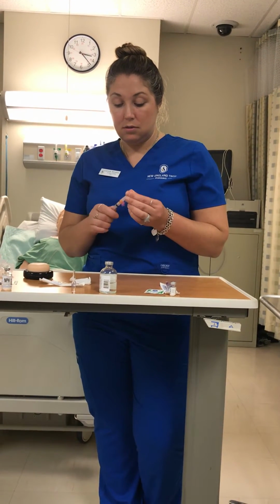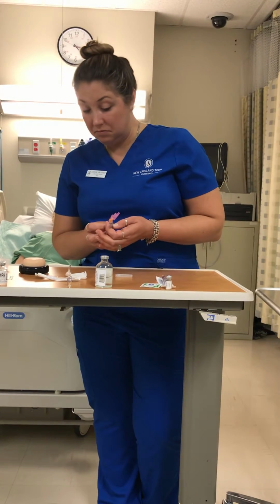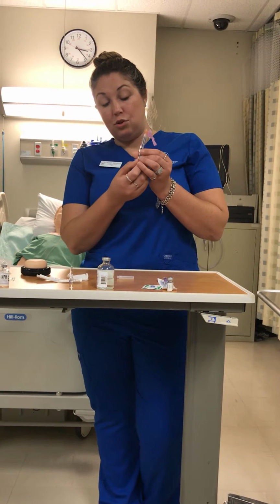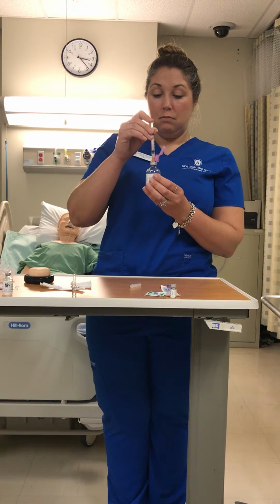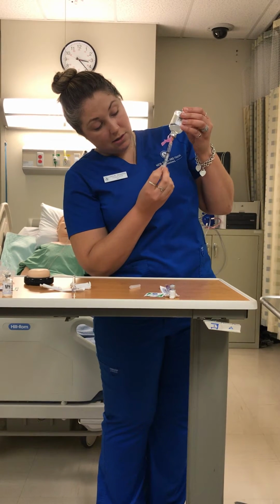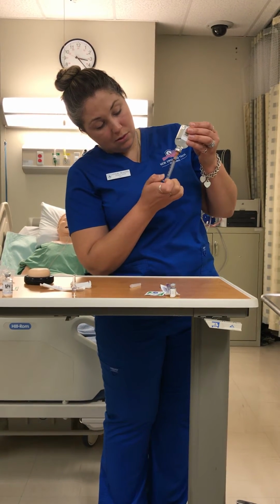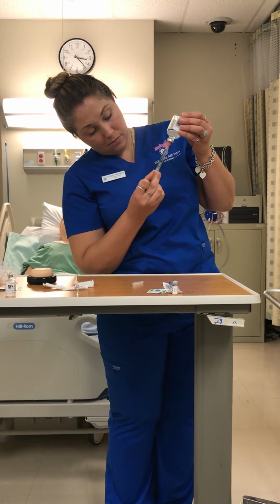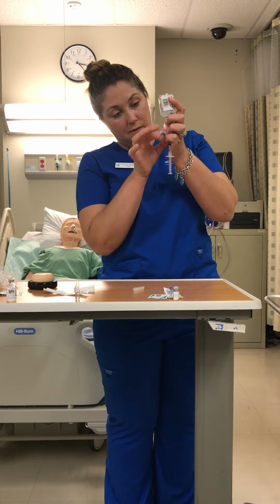Okay, you have to administer this one, take the cap off. You can say they needed 2 milliliters of medication. You would pull the plunger back to the 2 milliliter mark, stick the needle into the vial, plunge the air in, flip it over, and see how there's some air bubbles in there? You can push to get the air bubbles out. And you pull back to the 2 milliliter mark. Flick the needle to get the bubbles out.